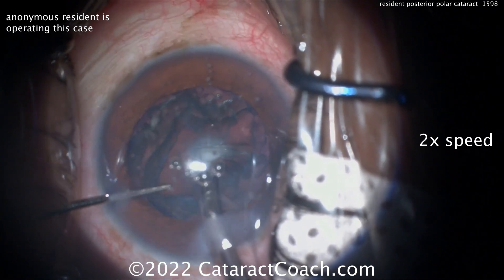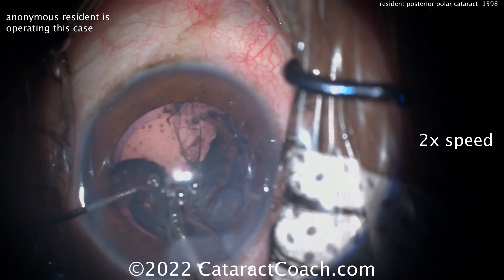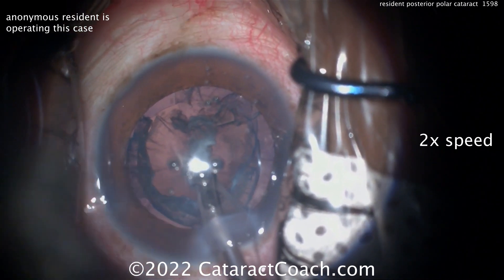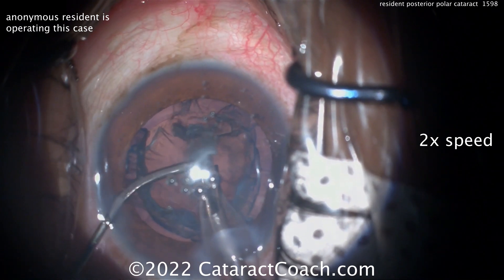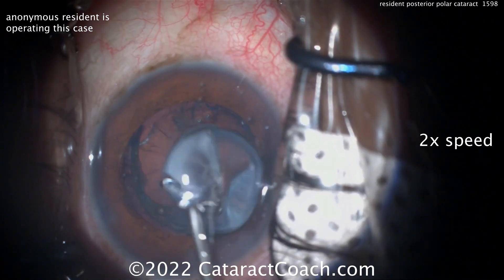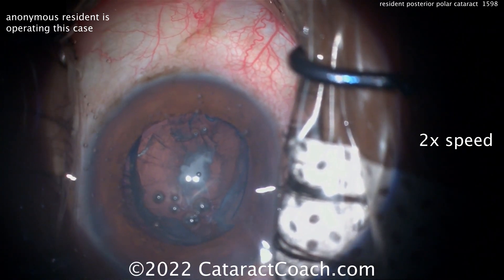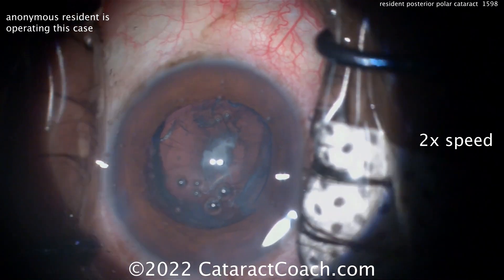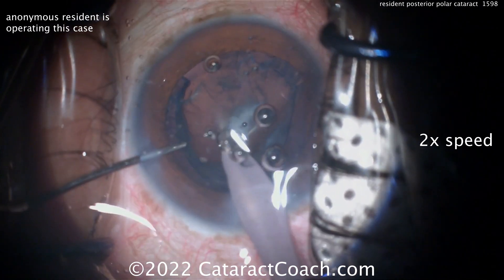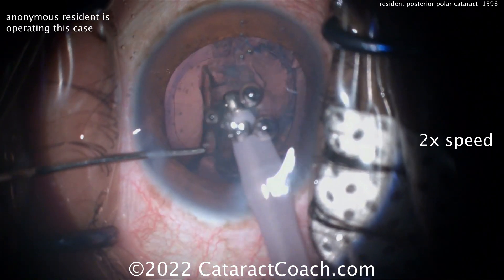An easier technique is using a dispersive viscoelastic to do some visco-dissection. You want viscoelastic to go between the capsule and that cortex and epinuclear shell. The dispersive, as it goes around, can protect and help dissect — plus it's slow motion. Plus, if there is a break, it'll go tamponade the break for you. Remember, a lot of times in these cases you can have an open posterior capsule through no surgeon fault at all — this is the nature of these eyes. As soon as that last plaque comes out of the posterior capsule, there's a hole right in the middle of it, and that can be managed pretty well.